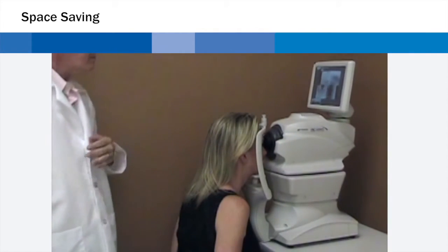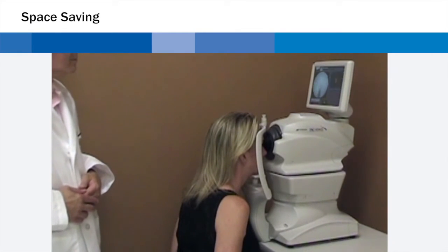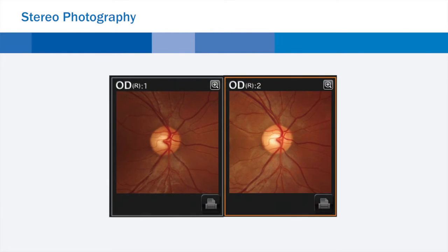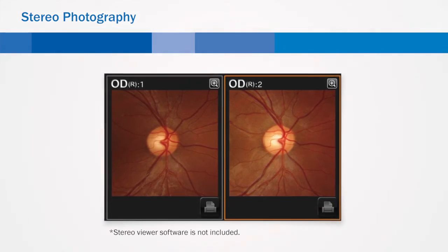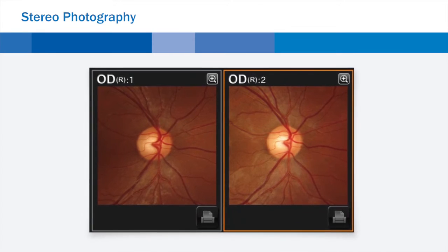The TRC-NW400 can also be comfortably operated when located against a wall or in a corner. While in stereo photography mode, the alignment for a stereo pair is performed automatically. Following the prompts on screen, a stereo pair for stereoscopic viewing can be quickly and easily acquired.